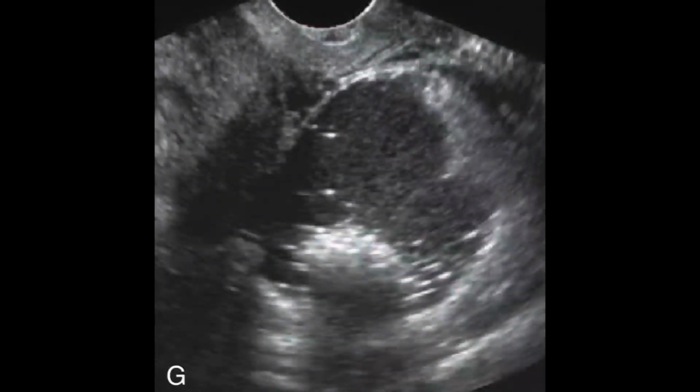This is another characteristic radiological pattern which you can appreciate in the dermoid lesion or in cystic teratoma. This is a transvaginal scan, and on it a well-defined complex cystic lesion can be seen. Now if you want to write these patterns, how will you write that?